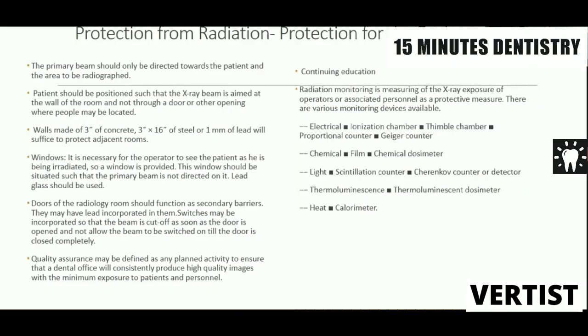There are certain criteria given by AERB for the thickness of the wall, whether it should be lead-lined, and the thickness of the bricks which have to be used, which you need to look up before you start your clinic. Okay, so these are very important. Continuing dental education for the operator, for the patient, radiation monitoring devices like your TLD badge, and also the environment where regular quality control checks are done by AERB and Dentech to find out whether there is any stray or leakage radiation happening from your machine.